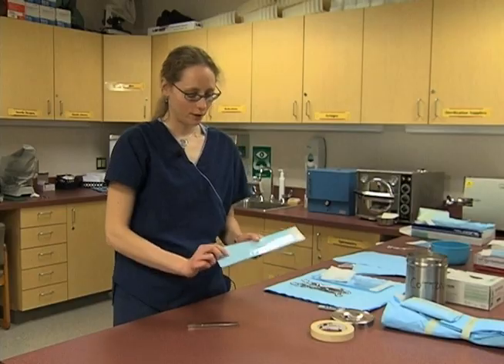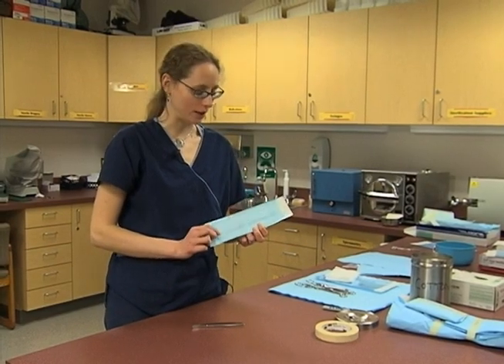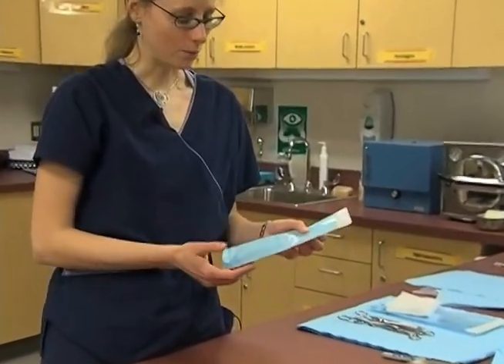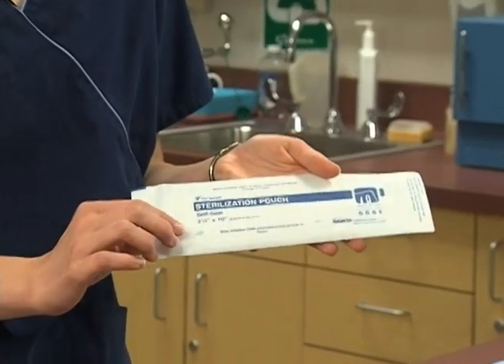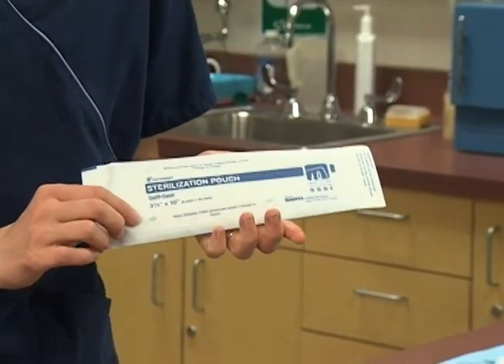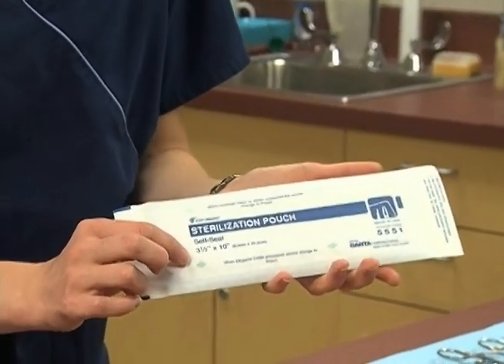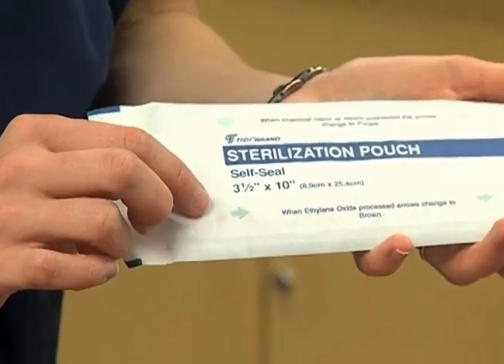A very common way to prepare instruments for the autoclave is to put them in a pouch. These sterilization pouches are already ready to go with an indicator on the package itself, so we do not need to put an indicator inside them. The arrows on the outside of the sterilization pouch will change color when they've been sterilized properly.